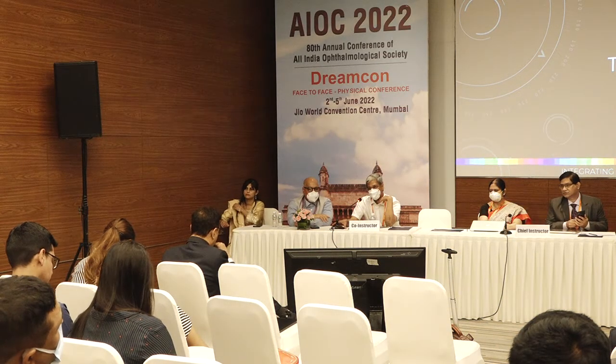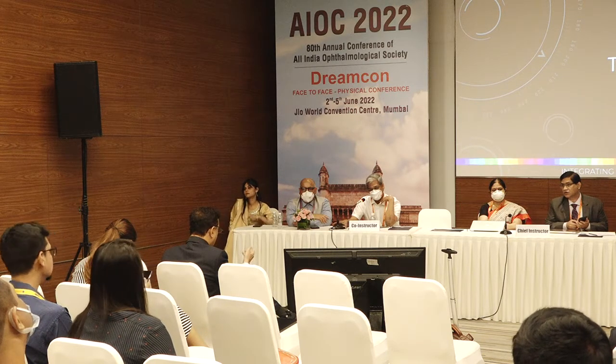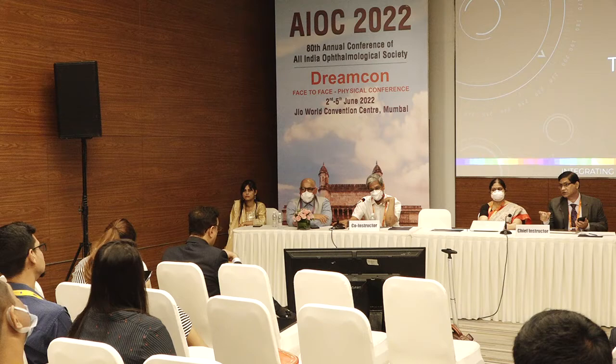Optical biometers also do that, right? Yes, they are more accurate, in fact. I'm using Anterion, and Anterion is also a topographer. It gives the different zones' readings. Yes, TOMI allows you to calibrate the zones, whether you want 2, 2.5, a smaller zone. Right, thank you.